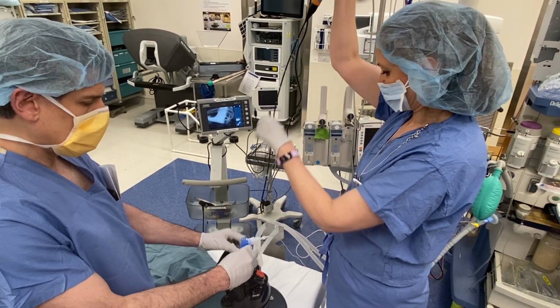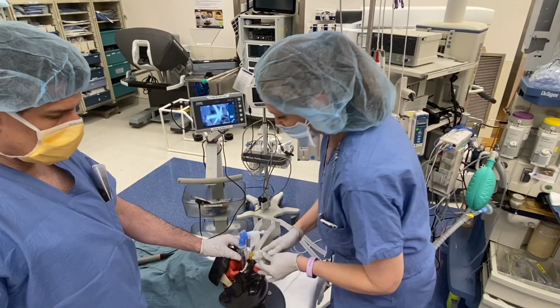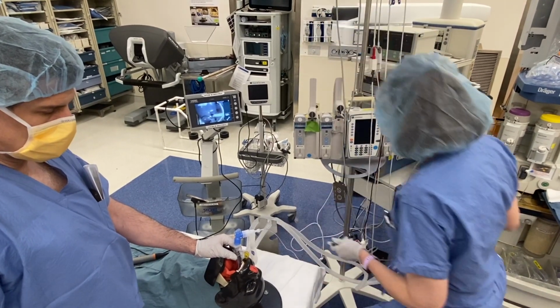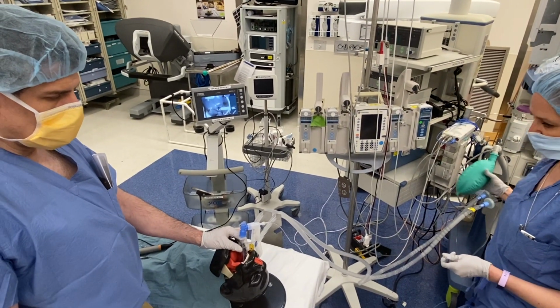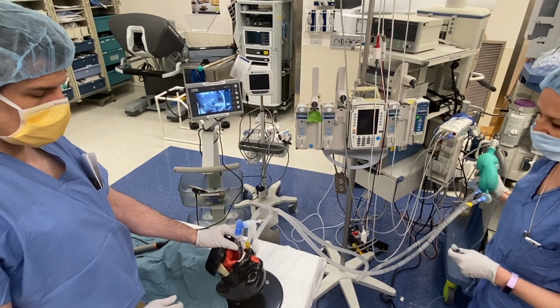you would then come on out, close off the hole and gently ventilate the patient, inflate the endotracheal tube cuff, and you now have a secure airway. At this stage, you can either leave the air-Q laryngeal airway in place or you can remove it.